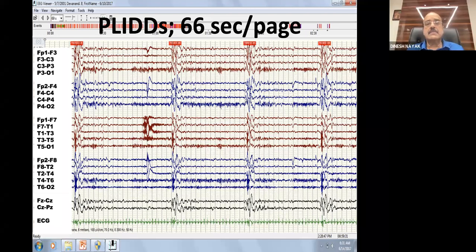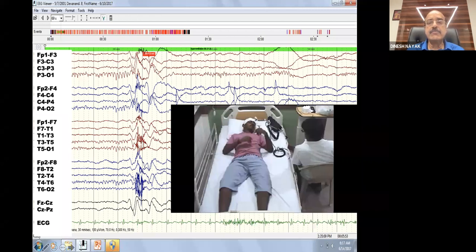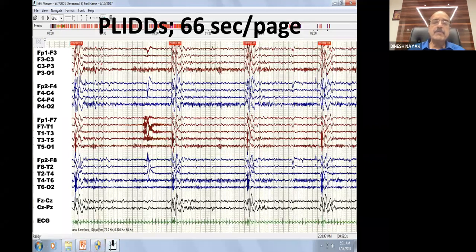And that discharge is clinically accompanied by a slow myoclonus, and I can show that myoclonus. Yeah, that's the one. Now that is classical of SSPE. In the very early stage of SSPE, the interval between discharges can be as long as 15 seconds. And the background is fairly normal. Between the two discharges, this looks more like an idiopathic generalized epilepsy syndrome, because you can see that these are bursts of a generalized sharp wave discharge, and in between the background is fairly normal.